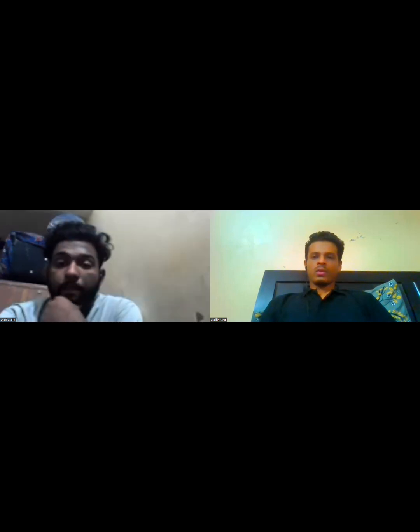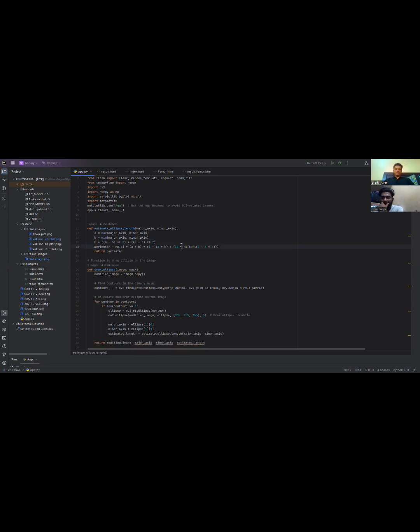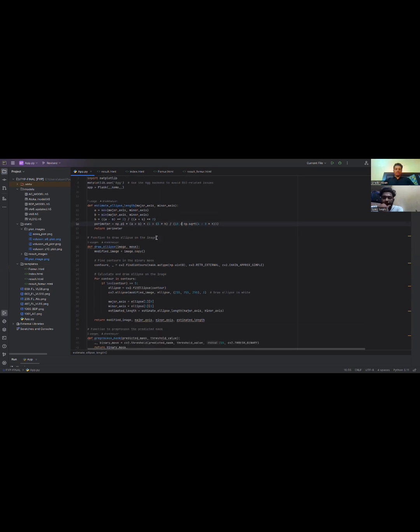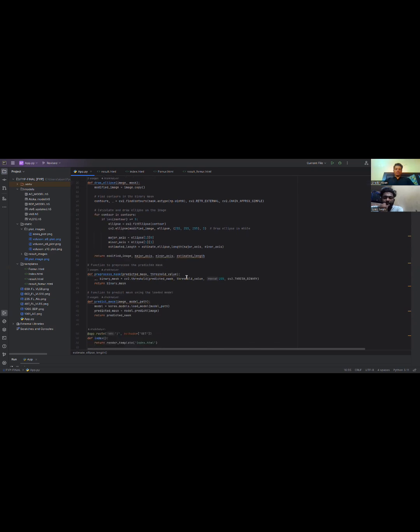After the training on Google Colab, we make the test code in the Python file. We first upload all the models. These are the object models that we have downloaded from the Google Colab file. So first we make the functions of ellipse and estimate ellipse length by these formulas. And these are making the ellipse on the contour, which is the biggest contour, the segmented region.